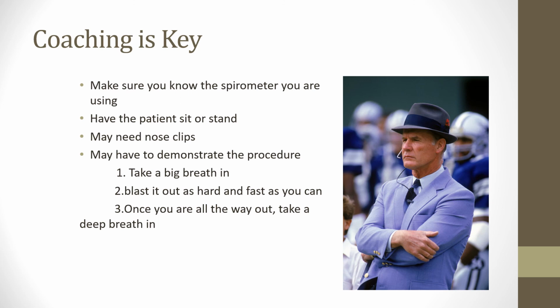Big thing here is have the patient sit up straight, really tall, or stand. Traditionally on adults, we have them sit up really tall. We don't like to have them stand because if you exhale completely, you can actually simulate a vagal response, especially with a full inhale and a full exhale. They could vagal and pass out. Not a good idea. So we try to have them sit up as tall as they can. Standing works as well. We just don't want someone to pass out and hurt themselves. So sitting is the most preferred method, and just make sure their back is as straight as possible, and they're sitting up as tall and as proper as you could possibly think of it.